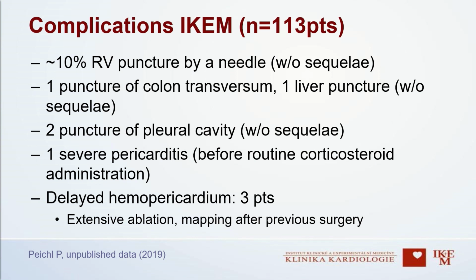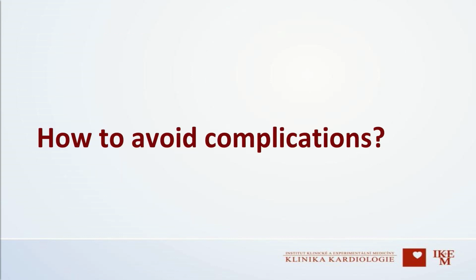This is analysis which Peter did a couple of years ago. At that time, we had more than 100 punctures, and we had some curious complication like puncture of colon, but nothing happened. We just had a nice picture of obstructions in the colon, but no sequelae. And we had one severe pericarditis and delayed hemopericardium in 3 patients. So we believe that the way how we do it is reasonably safe.